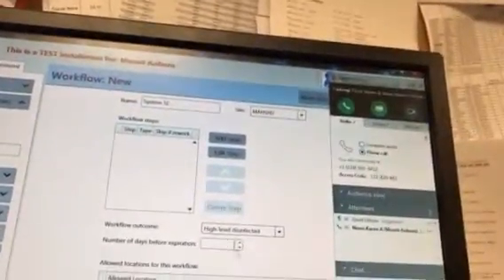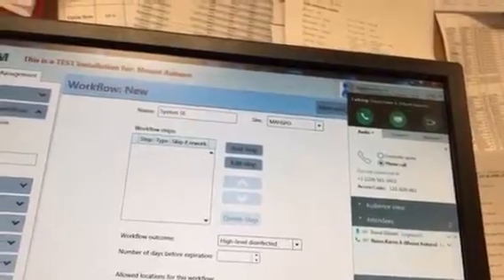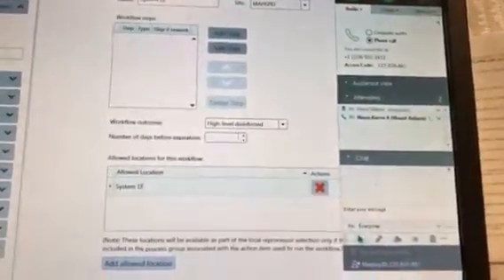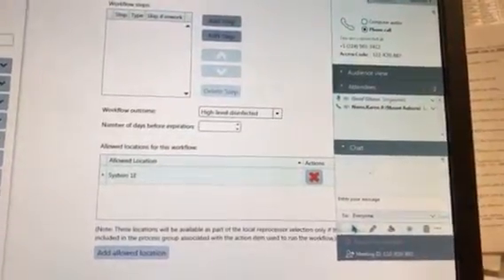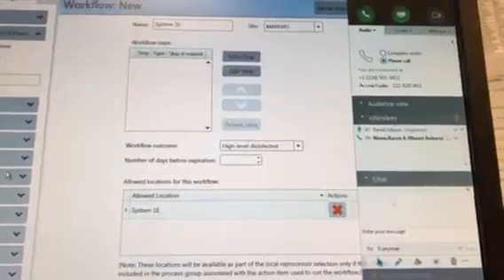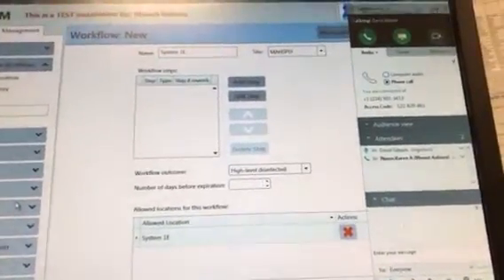Okay, and then expiration date of the product after it's cleaned in high-level disinfectant, or expiration date of the indicator? Of the product. So that would be, like you said, 7 days, right? 7 days.